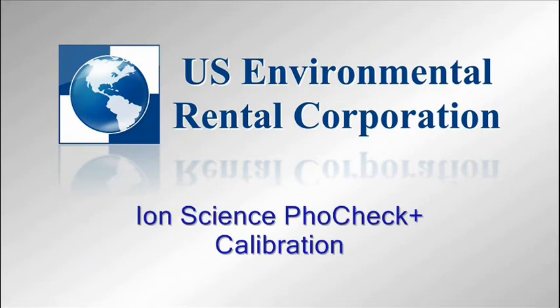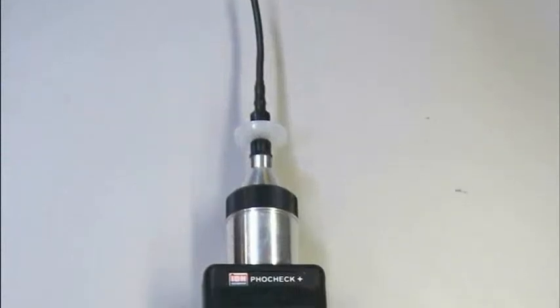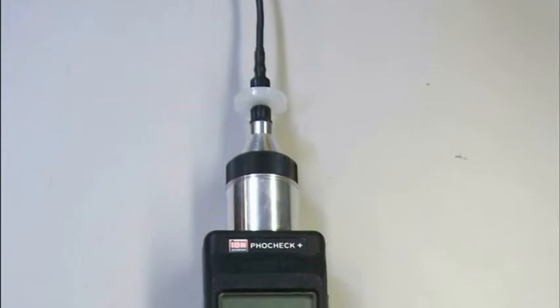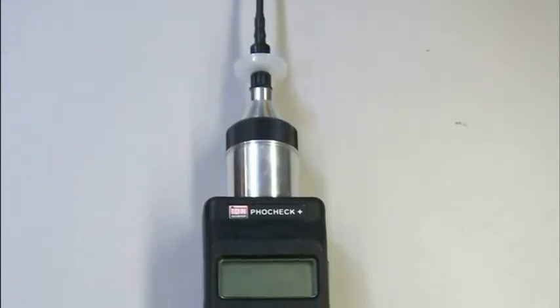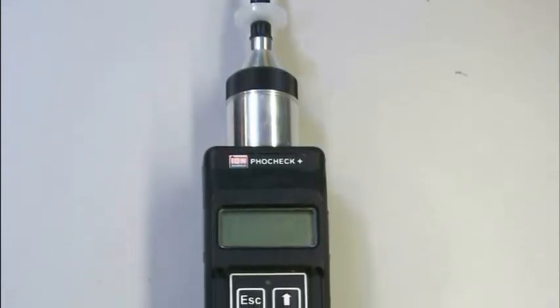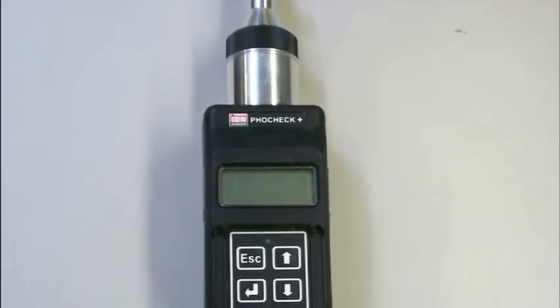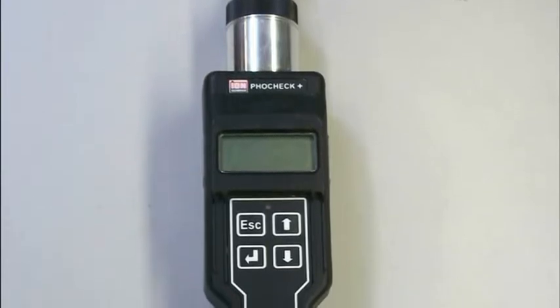In this video, we will calibrate an IonScience FOCHECK Plus photoionization detector. Photoionization is the process by which an ultraviolet lamp ionizes volatile organic compounds. The ionized gas then passes over a sensor which detects the charge and converts that signal into a current. The current is then amplified and displayed on the unit as a reading in parts per million. The FOCHECK Plus detects VOCs at a range of 0 to 10,000 parts per million.